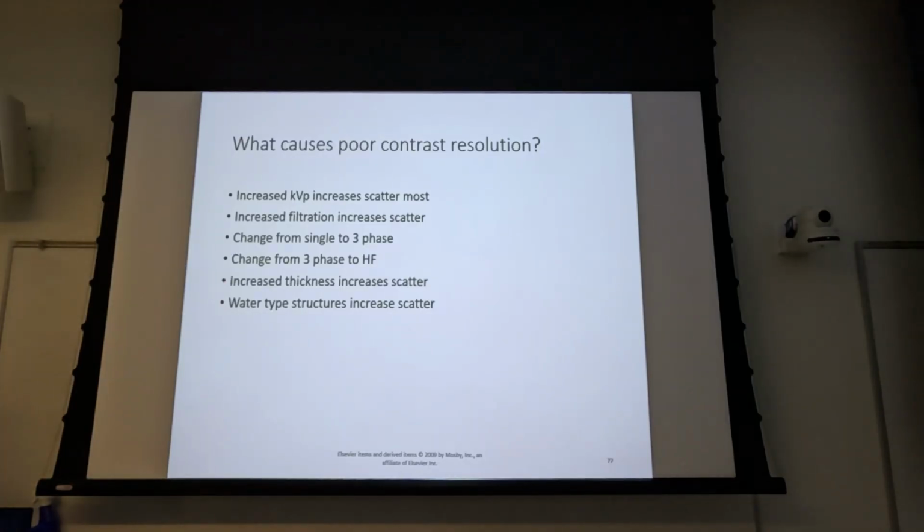So what's probably going to wind up happening is somebody's going to prove it, and then the hospitals are going to start using it, and then eventually it'll make its way into the textbook. But just thinking about it from all different aspects, as you increase kVp and decrease mAs, patient dose goes down. What happens to heat in the X-ray tube?